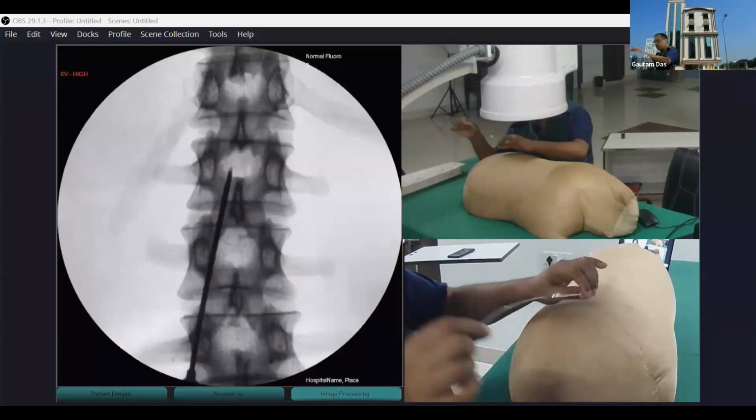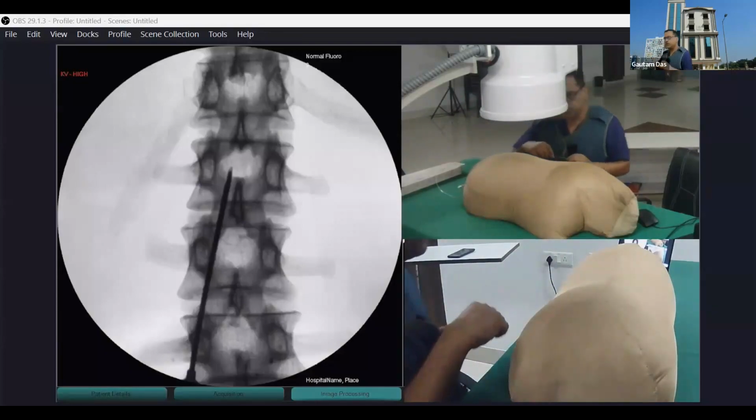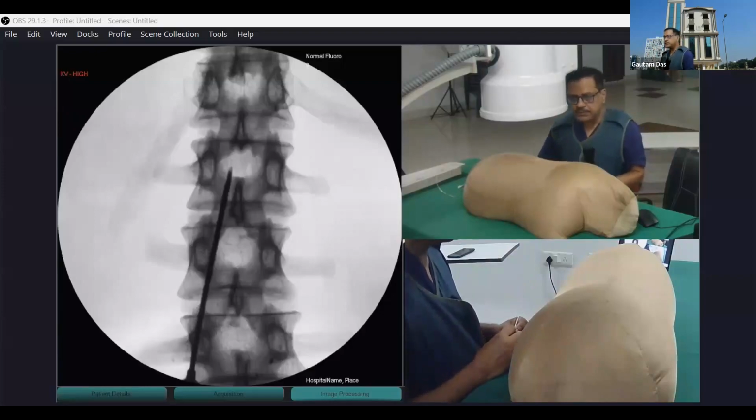So if the angle is much more, it is going to cause a dural puncture, and also you cannot steer the catheter nicely. Most commonly for the lower limb, our lead should be somewhere in the thoracic area. For that, the most common entry point is at the level of T12-L1 or L1-L2. So that is the common area. In the actual patient's video, we entered one lead at the level of T12-L1, another at the level of T11-12. Most commonly T12-L1 is the area.